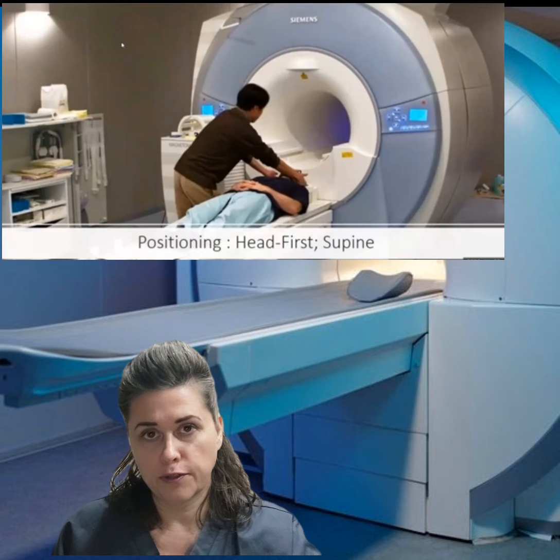MRA stands for magnetic resonance angiography, and we use it to look into the big blood vessels, arteries, and in our case we will be looking at the large arteries in the inferior portion of the brain. The landmark for those exams is going to be glabella. The patient will be lying on his back, supine, head first.